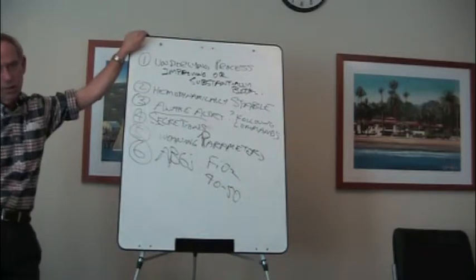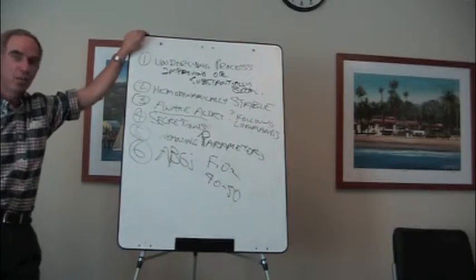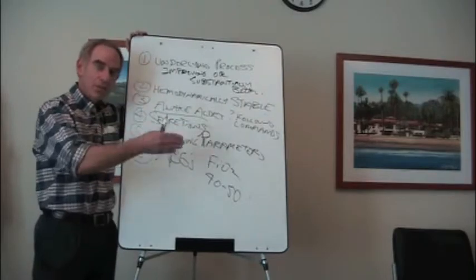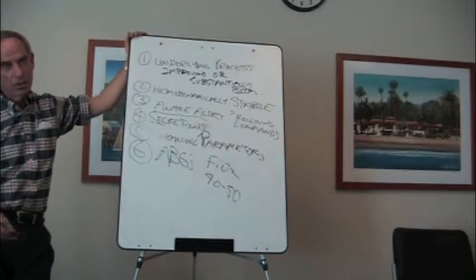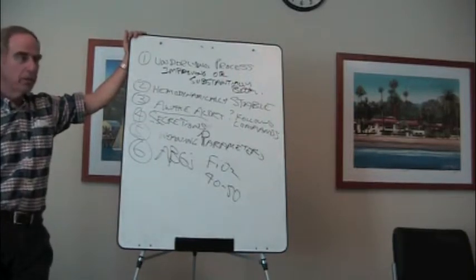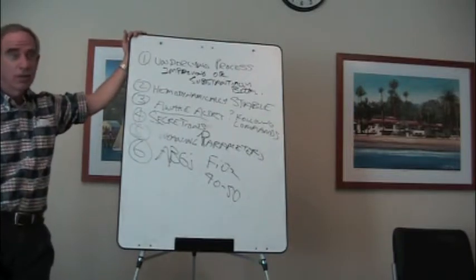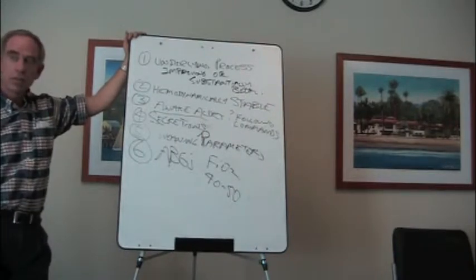I know you guys all look for a single number and you want to know yes or no, black or white. Nothing is black and white in medicine if you haven't figured that out yet. Every intensivist and every pulmonologist you ask will give you a different answer to this question based on their personal preference, experience, but not a lot of science. There is a lot of variability. And one patient I might be willing to tolerate 50%, another I might not.